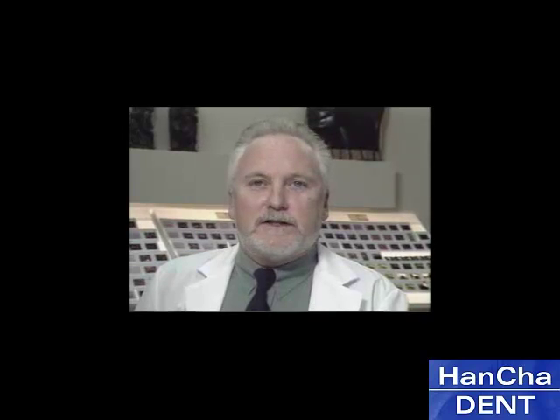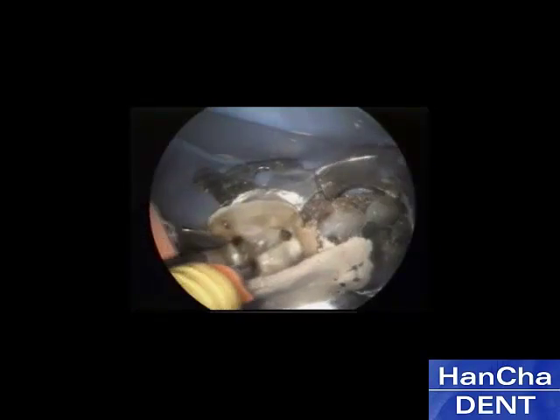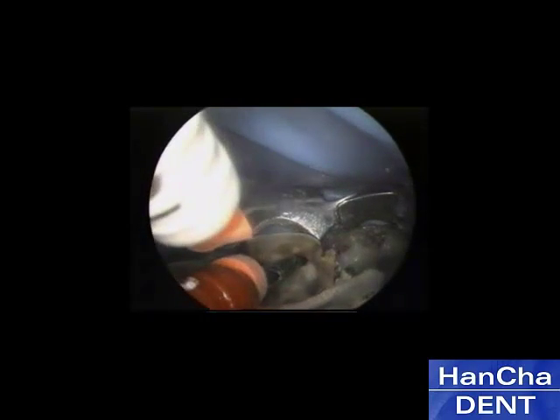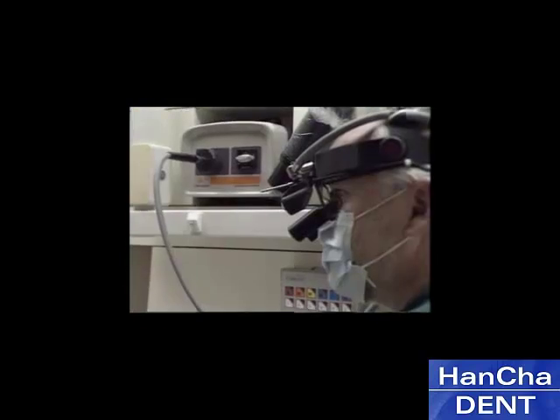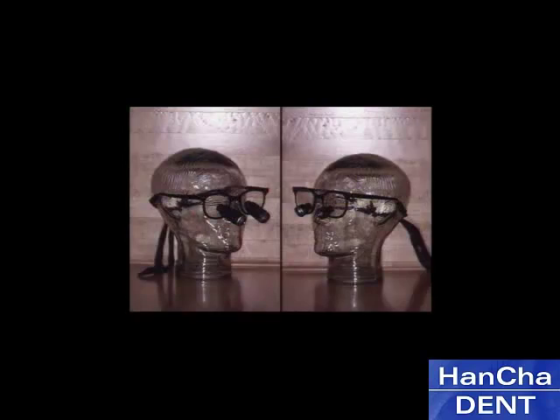The paramount importance of enhanced visualization must be stressed at this point. The ability to actually see the file tips as they enter the respective orifices is critical and cannot be reliably performed without the benefit of magnification and enhanced illumination. While any level of magnification and enhanced lighting will improve the clinician's ability to perform these procedures, at least 3x to 4.5x and 4,000 foot candles of head-mounted illumination is recommended.